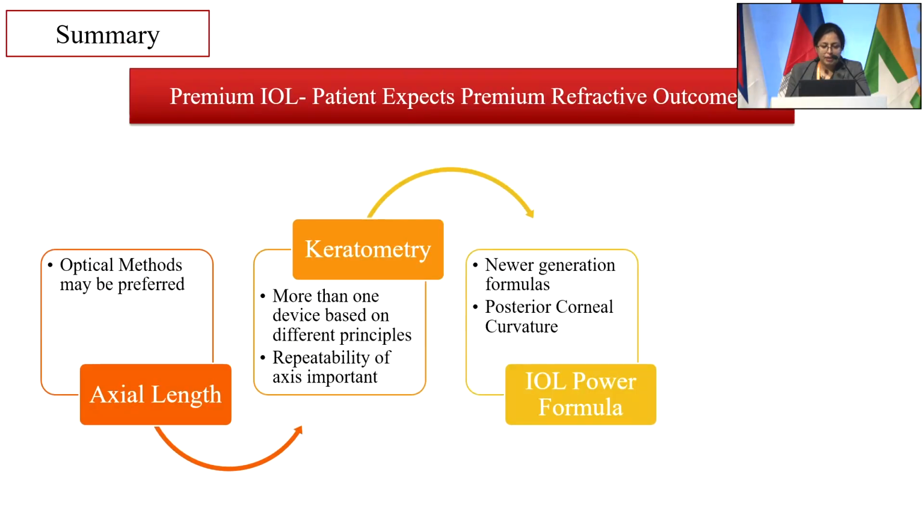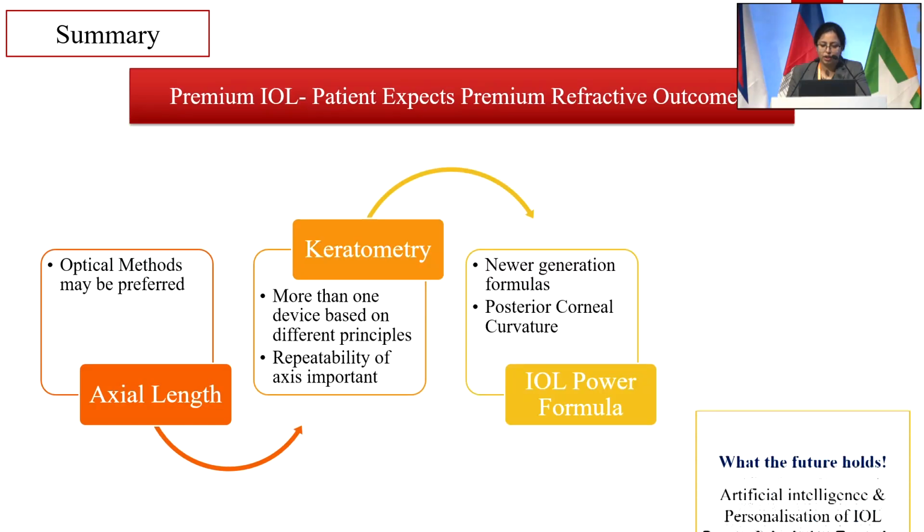So just to summarize, premium IOL patient expects premium refractive outcomes. Axial length optical method should be preferred, keratometry, more than one device based on different principles, repeatability of axis is important. IOL power formula, use the newer generation ones and do take into account the posterior corneal curvature.